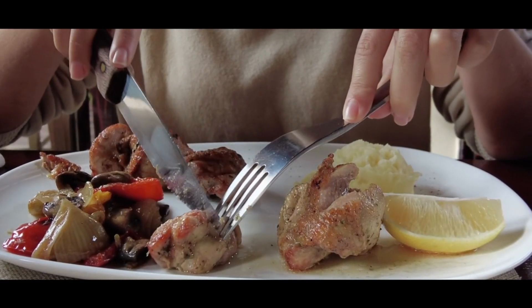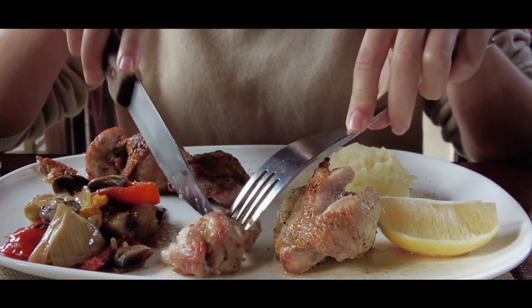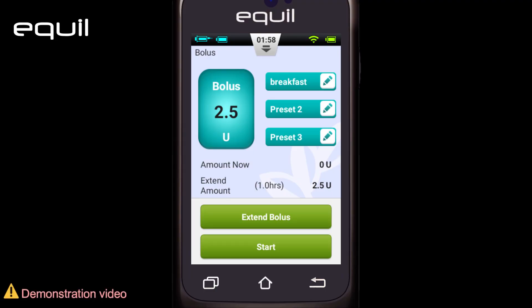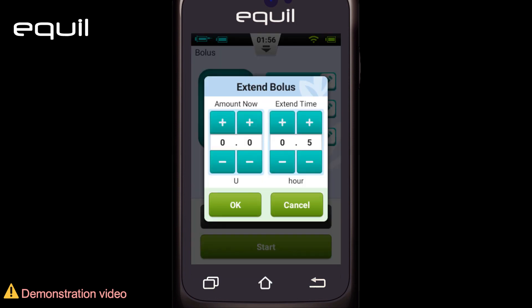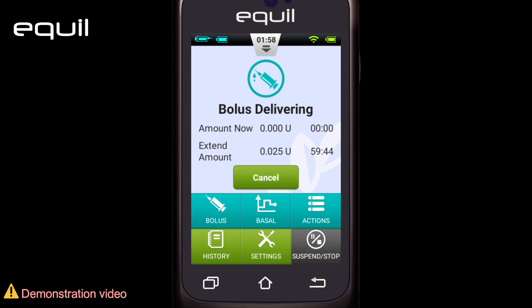If we have eaten a high-fat meal, an extended bolus without an 'Amount Now' can be helpful, and it can be administered over a time period between 30 minutes and 8 hours. Set the 'Amount Now' to zero — no immediate bolus will be administered, and the total bolus amount will be delivered over a specified time period.